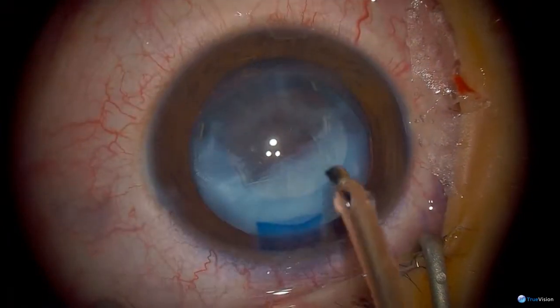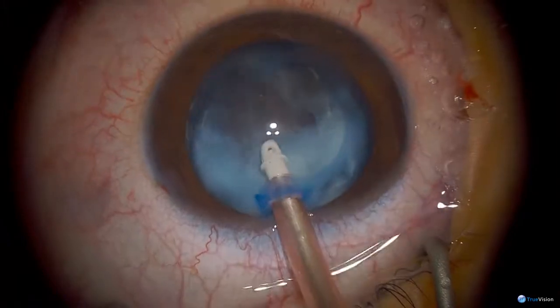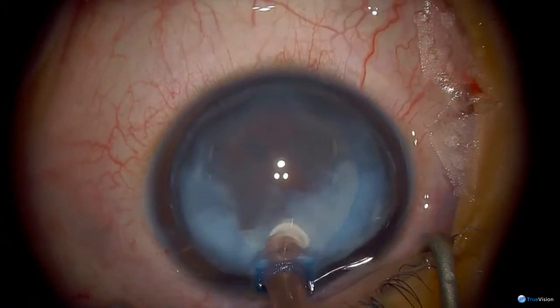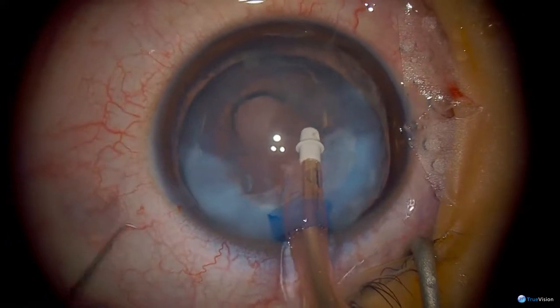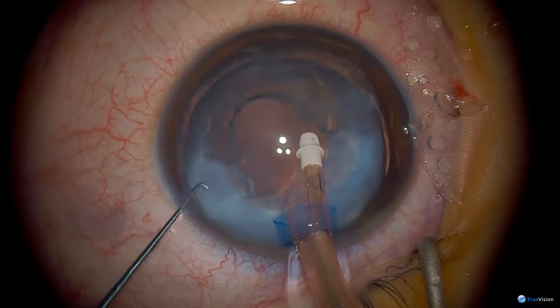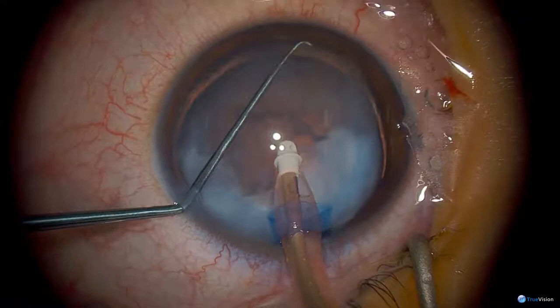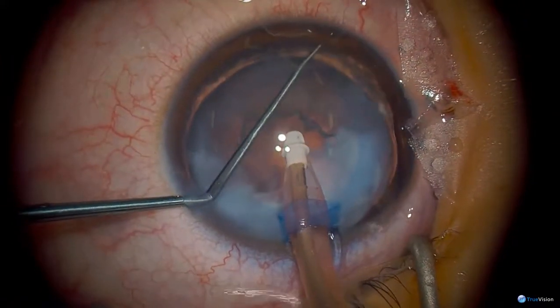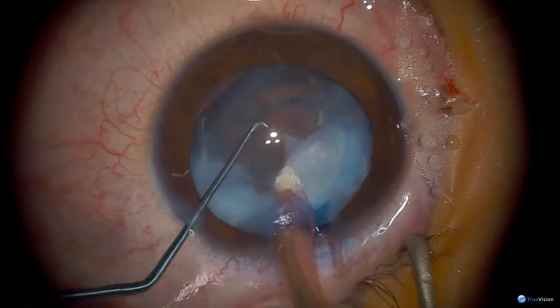We'll just try the IA now please. Are we on IA? Cortex — that's great, thank you. You notice how the anterior chamber has deepened a lot when I put the infusion in, and that's due to reverse pupil block. I'm going to use what's called the Cioni manoeuvre, described by Bob Cioni, to lift the iris up, and that shallows the chamber again.